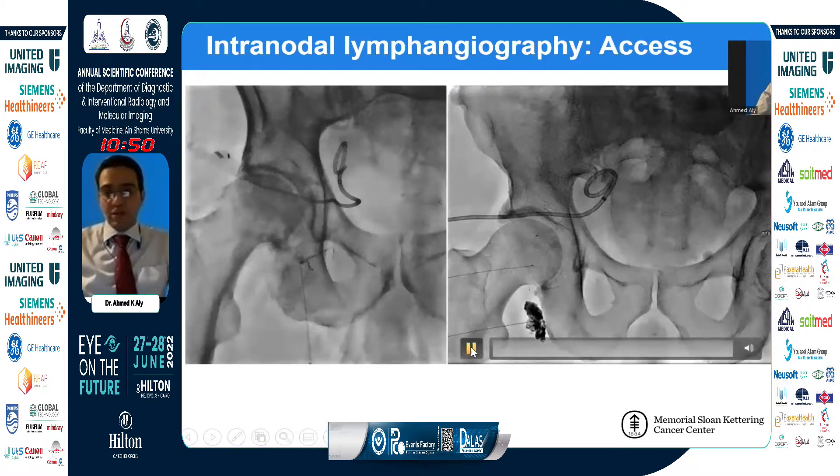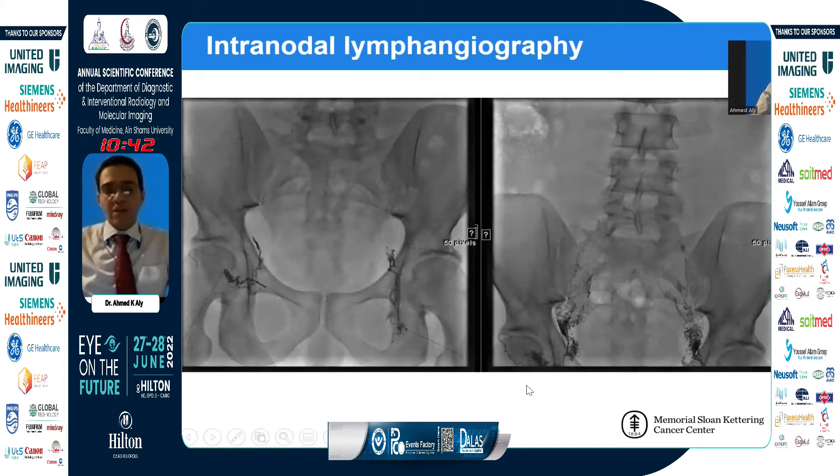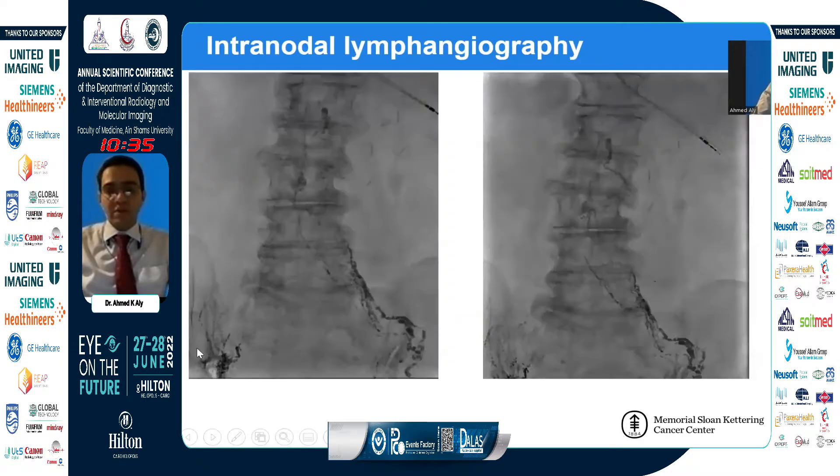Once we access a new lymph node, we start injecting and look for the ascent of lipiodol through the lymphatic structures. We take fluoroscopic spots every 30 to 60 seconds, waiting for the contrast to ascend through the pelvis, upper pelvis, and abdomen, all the way to the cistic structure we call cisterna chyle. We do bilateral access if we're not sure where the leakage is coming from, such as in cases of ascites.